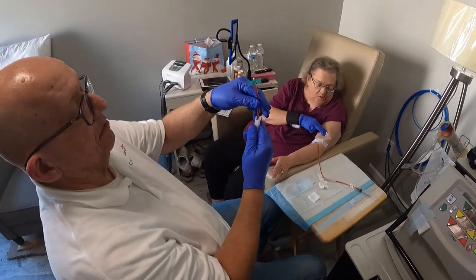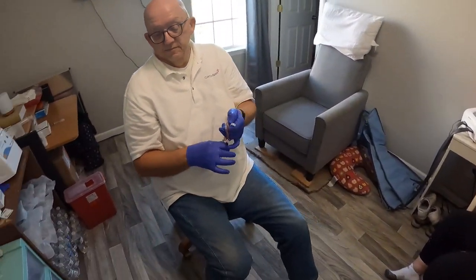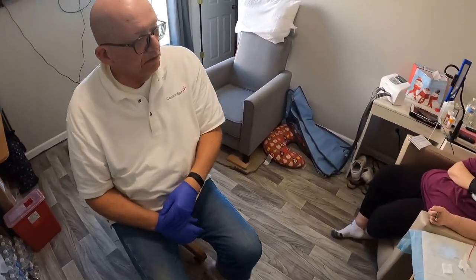And so while I'm holding this first one, your dad then breaks the machine down. I don't know if you want to watch. Yeah, we're going to do that right now. We don't need to make dialysate, or you can watch the process too, but we have to make it.